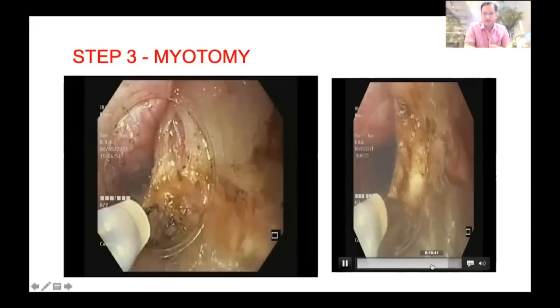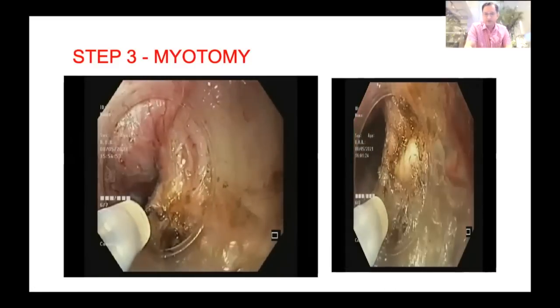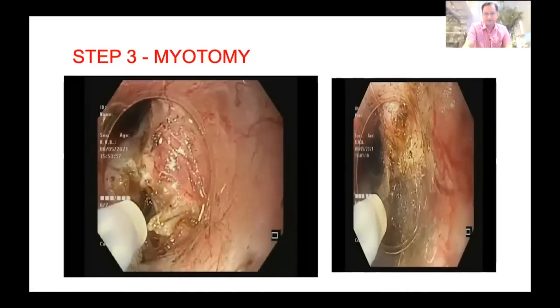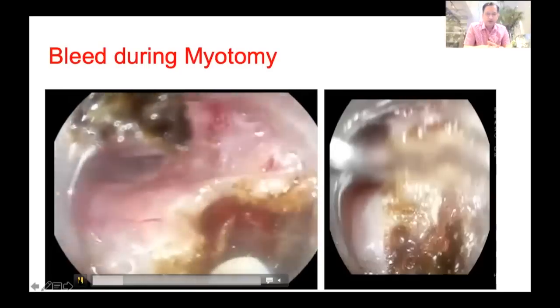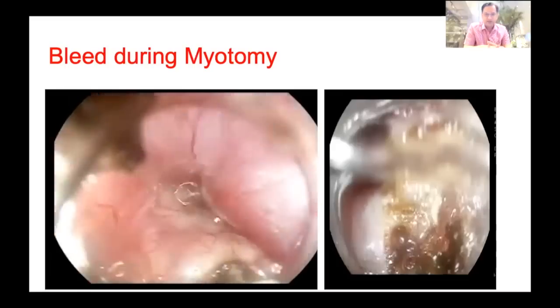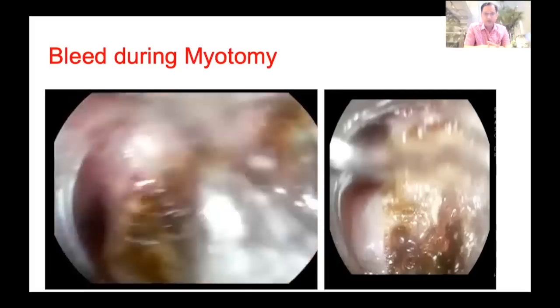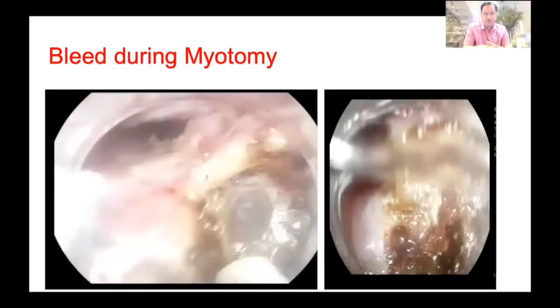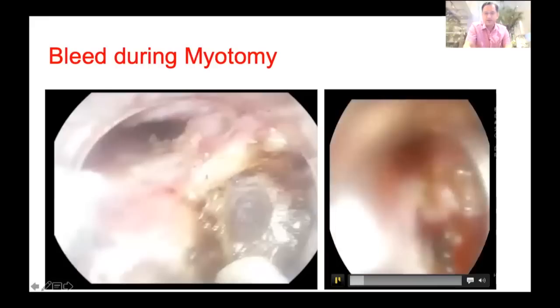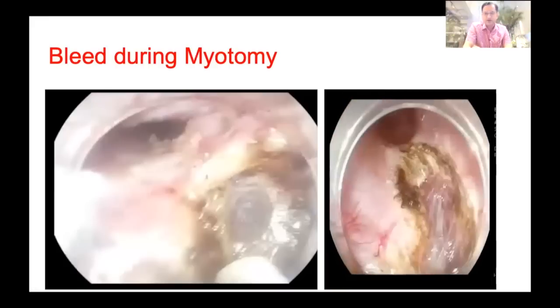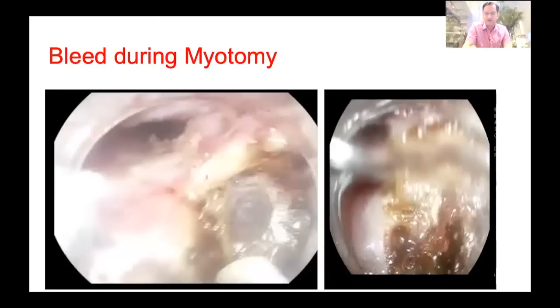I am extending this myotomy into the stomach to ensure a proper result. During myotomy you can encounter bleeding — in this case bleed happens from the apex, and as I extend the myotomy the bleed site comes to the right margin, which is adequately controlled by applying a few strokes of coagulation current. In another case, bleed from the right margin of myotomy is also controlled by coagulation current only — no coagulation forceps were required.